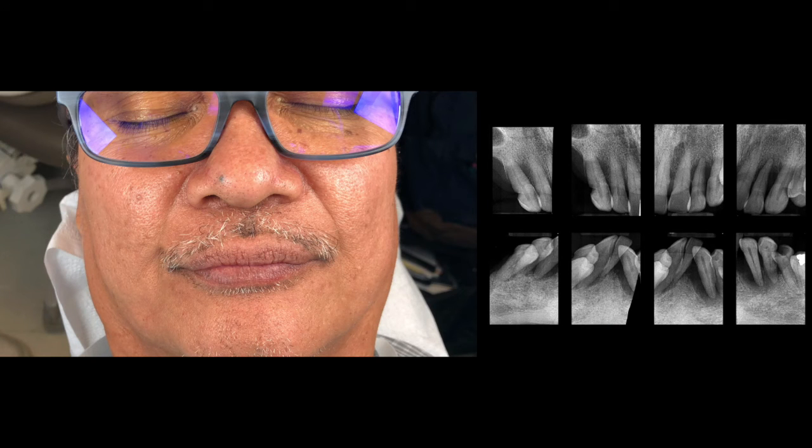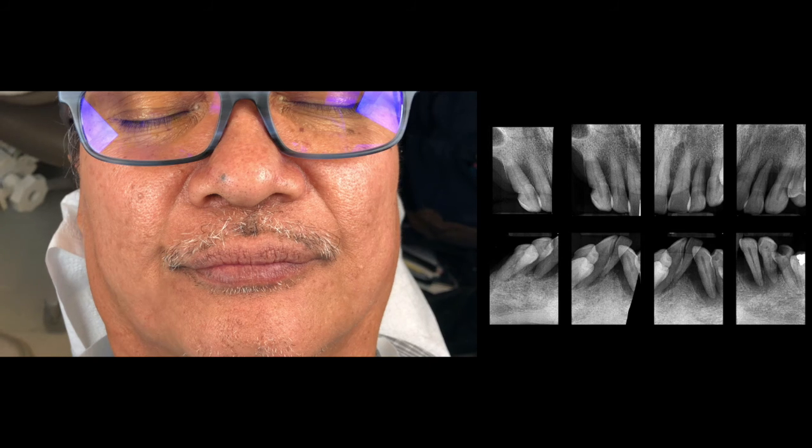This gentleman came into our student clinic, and as you can see on the right side radiograph, all the teeth are literally floating. So the teeth have mobility greater than 3. Let's take a look at the condition he has.